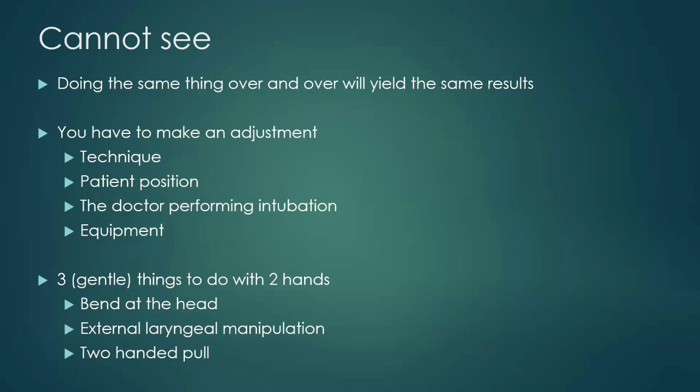Obviously, if you are also in a situation where you're using a double setup, that might be a bit difficult, because it might be the most senior person who's actually going to be setting up for your surgical airway. But it should be the best person to do this. We're not going to be having the student intubating a patient in this scenario, because first pass success is what we're aiming for here. And there really is very little margin for error.